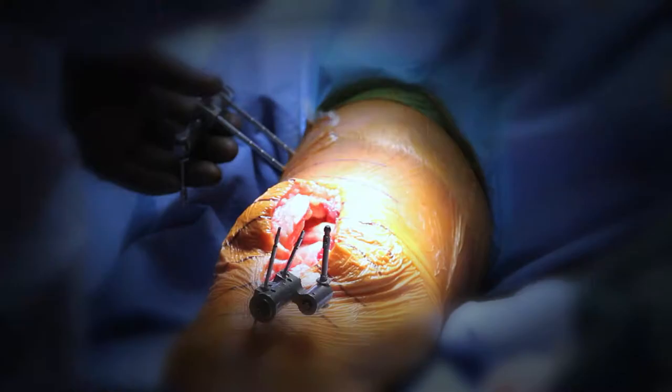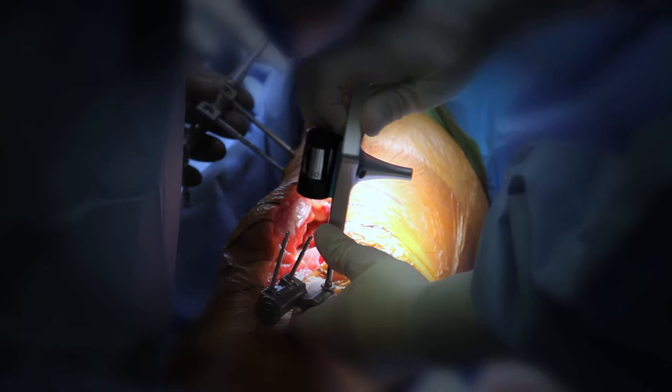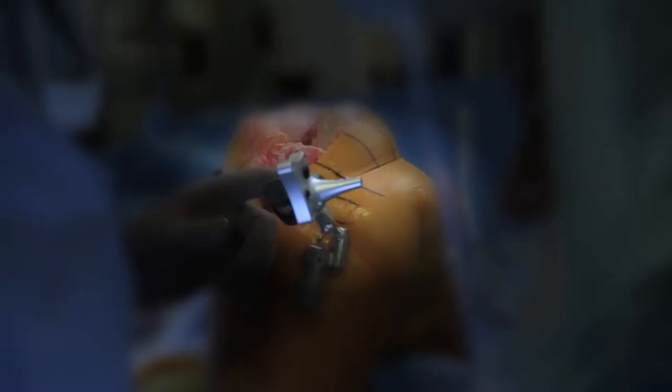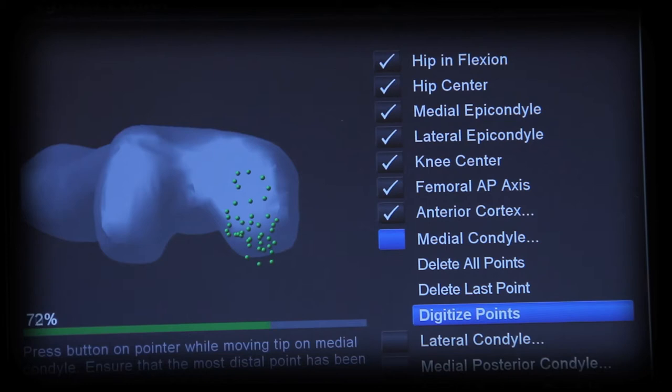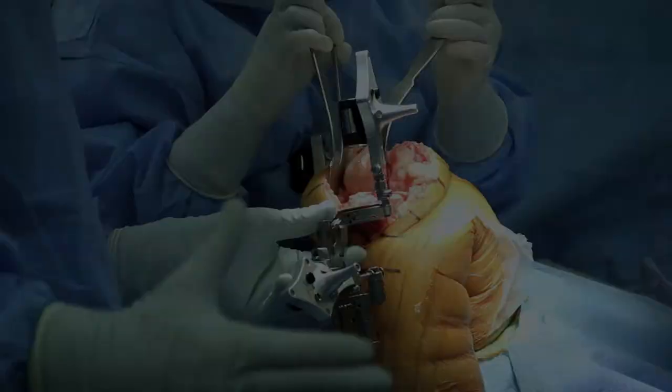While I anticipate covering computer navigation in more depth in a future video, I use this particular technology to increase the chances that I'm going to put the implant in exactly the right position in every single knee. At the beginning of the procedure, the surgeon and the assistant assemble the computer navigation equipment on the leg of the patient, and data points are gathered by the computer describing where the leg is in space.